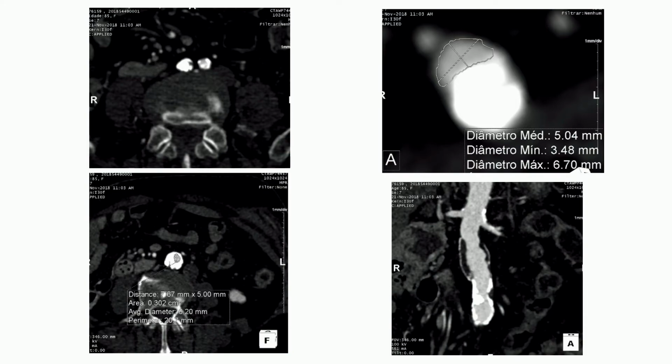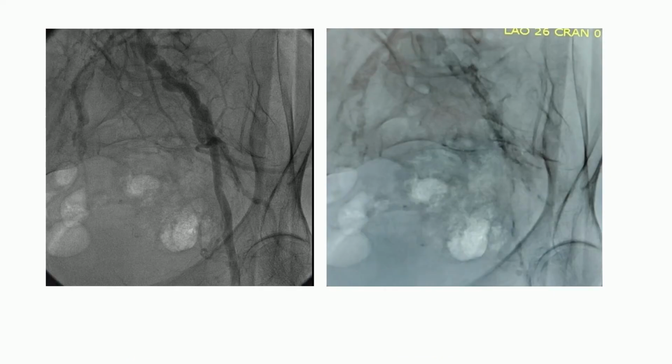This is the CT, the calcification of the right iliac, and huge calcification of the aorta, and a very tight stenosis of the left iliac.